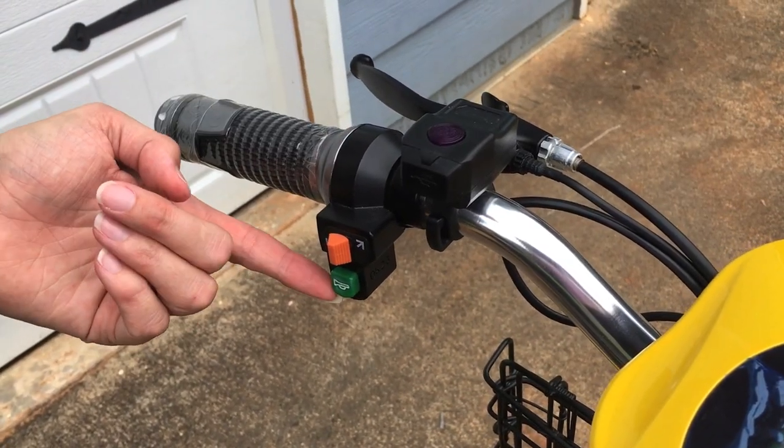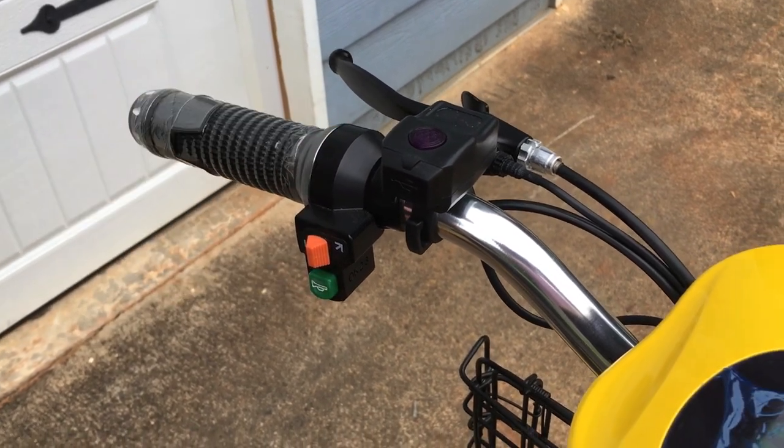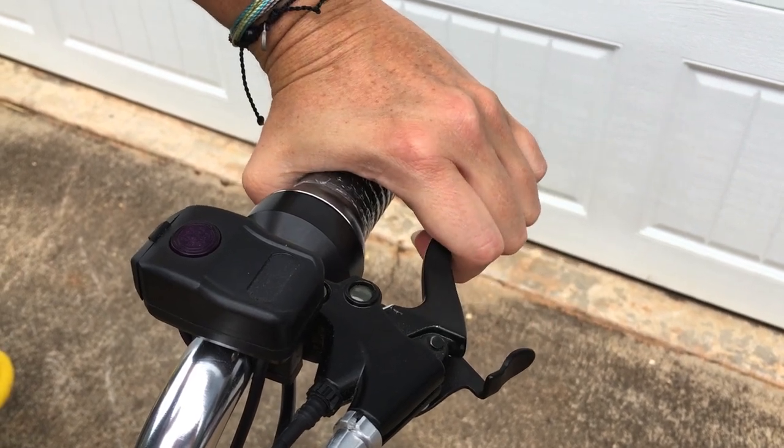Directly below the turn signals is your horn — this green button. These are your brakes, so you pull back to engage the brake.